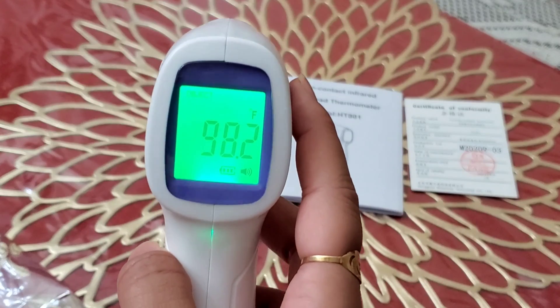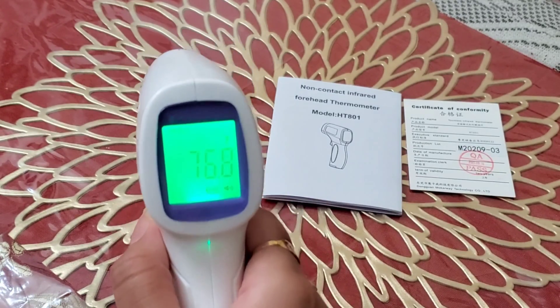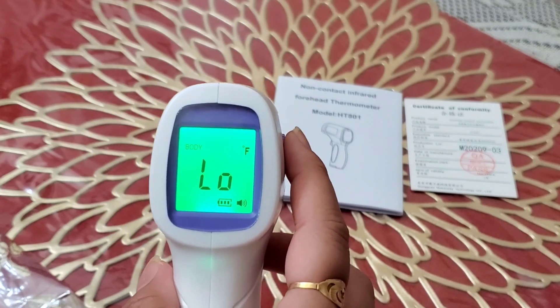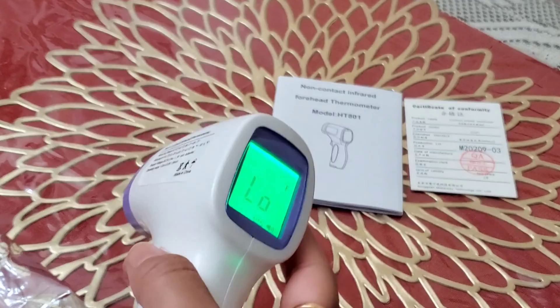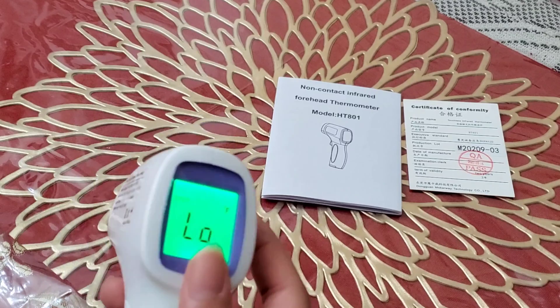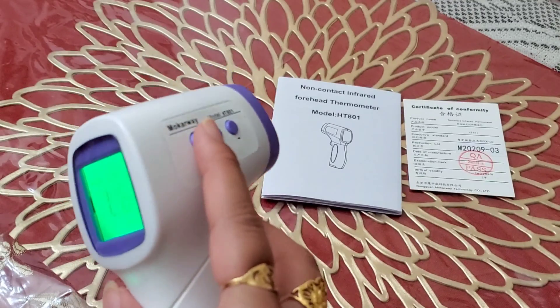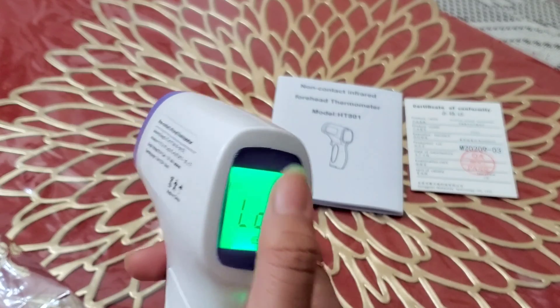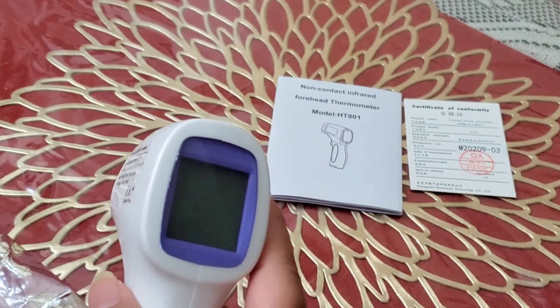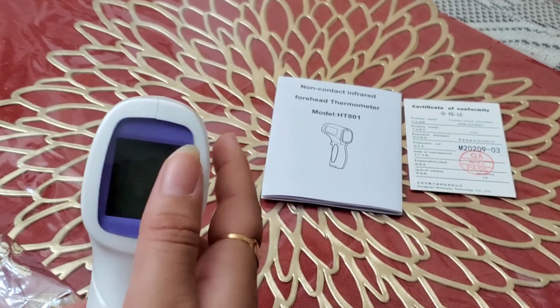Now I'm going to demonstrate one use of it. I'll try it on the table, which is an object — you can see it's lit — and I click the trigger and zap it: a cool 76.8. If I switch the setting from object to body, it says that's a low temperature for a human body, which is true. Sometimes you might need to know whether someone has hypothermia, or if an object is too cold or too hot. The thermometer also lights up in various colors: green indicates cooler temperatures, yellow means it's going to a hotter range, and red means it's definitely hot — something to be worried about.